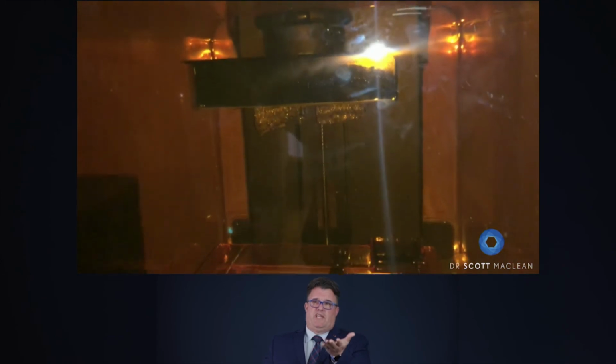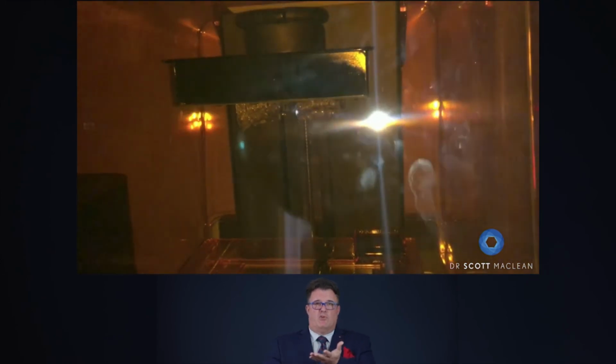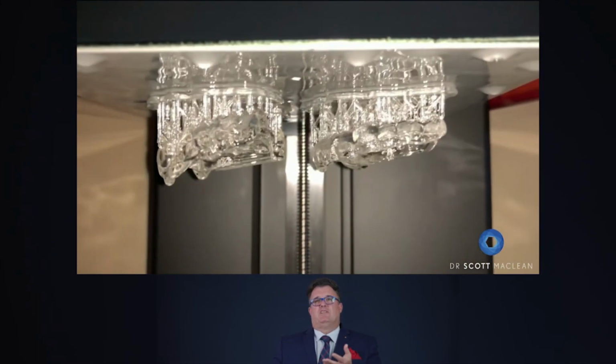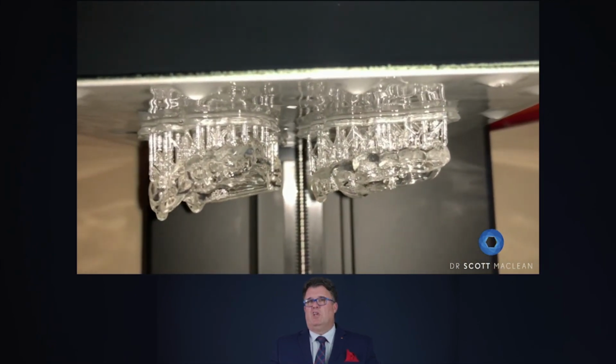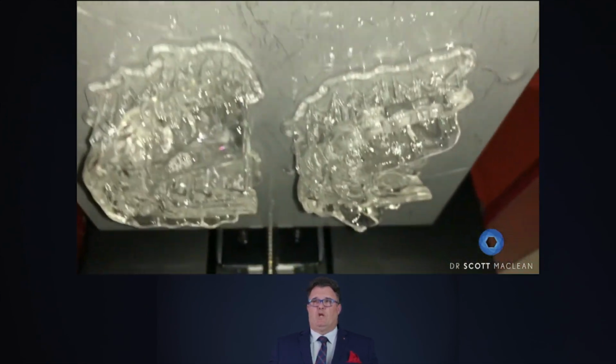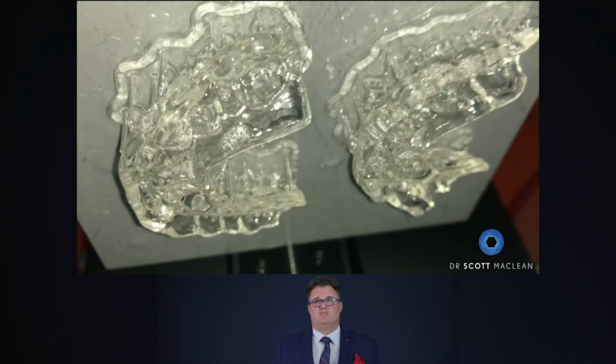And you can see them hanging down. So it prints in layers by a little laser going back and forth, whether you have an SLA printer or a DLP printer. So it gets a little bit, not that confusing. It's about resolution and speed. So you can see that these are very quick and very easy ways to produce things.